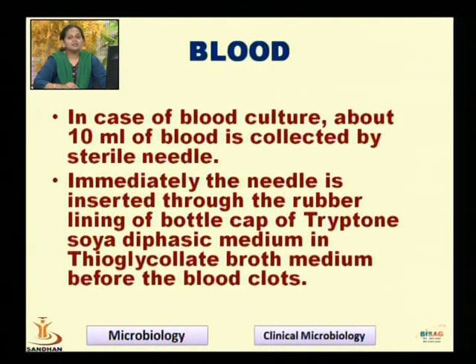Organisms in these tubes, as they are the enrichment mediums. These tubes are further incubated at 37 degrees centigrade for 24 hours, and then on the next day the growth of the microorganisms is studied.